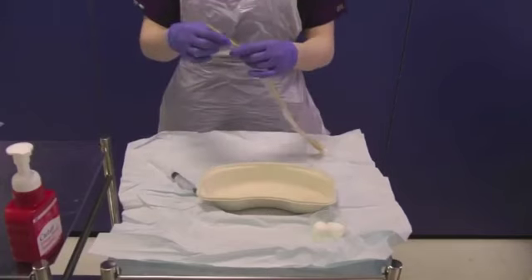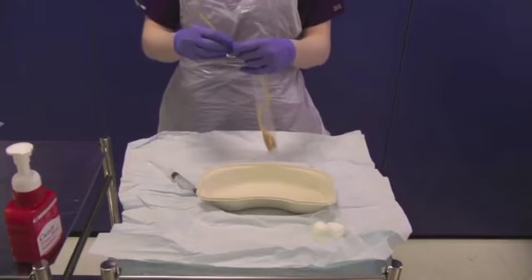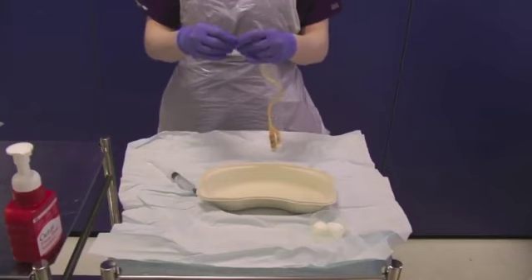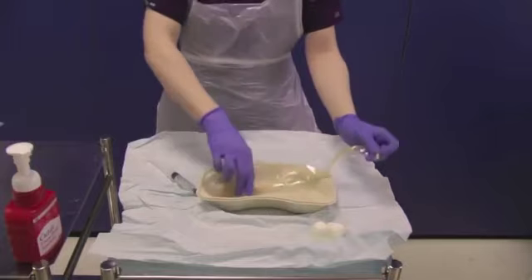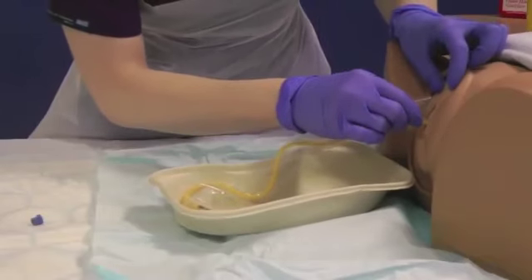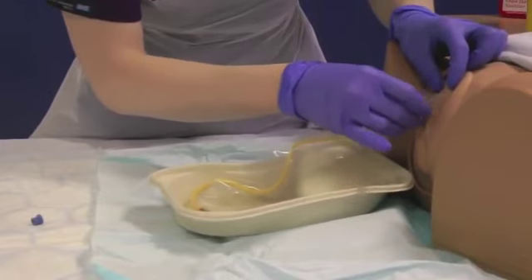Open the urinary catheter from its sterile packaging using the perforations to help you, exposing the catheter tip only. Hold this in the sterile J tray and place onto the bed between the patient's legs. Avoid touching the catheter directly using the packaging as a barrier. You may need to part the labia at this point.